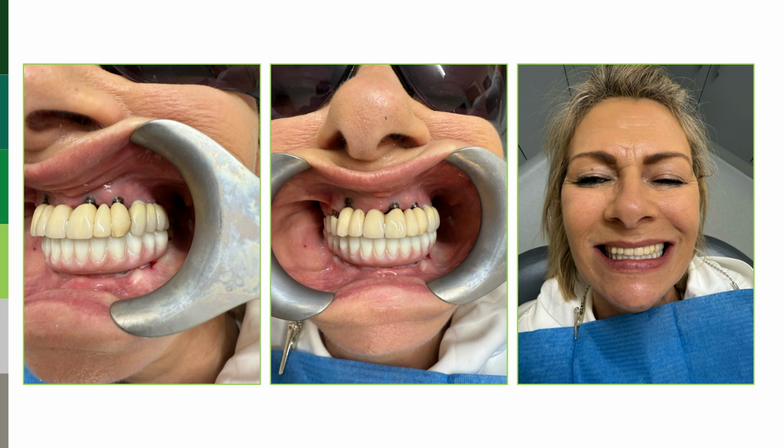Here's the case I showed briefly earlier on. This particular lady was a little bit pushed for time, and she travelled over 3.5 hours to come to the clinic. So we were really trying to reduce her burden in terms of chair time. The lower restoration had already been completed in the previous year, and now we were looking forward to doing the upper. As I've said, these implants were removed using a guided process, and new implants placed. The patient was then wearing a temporary bridge.